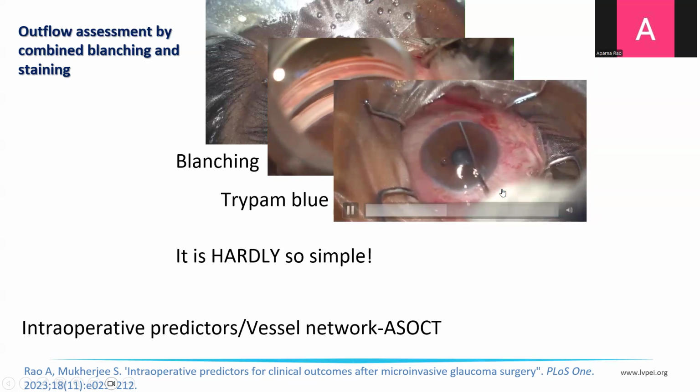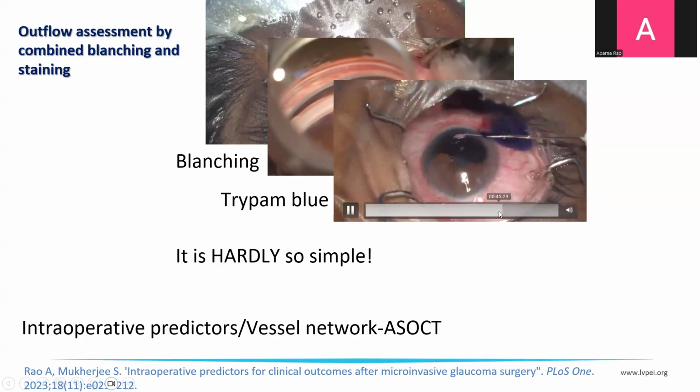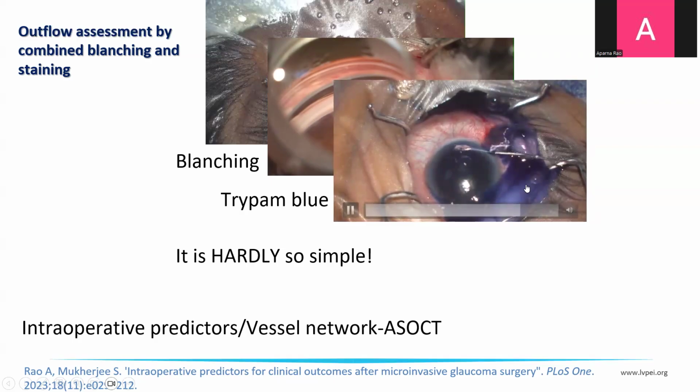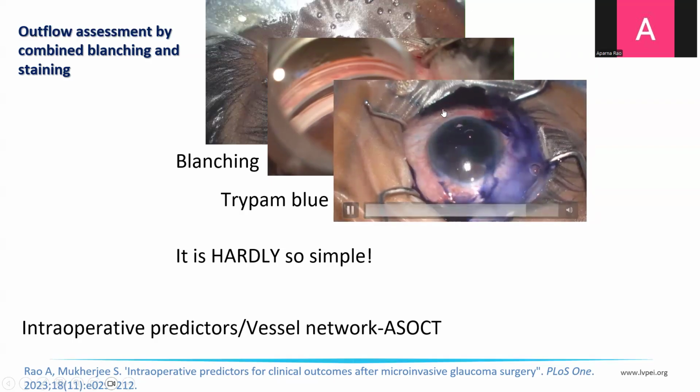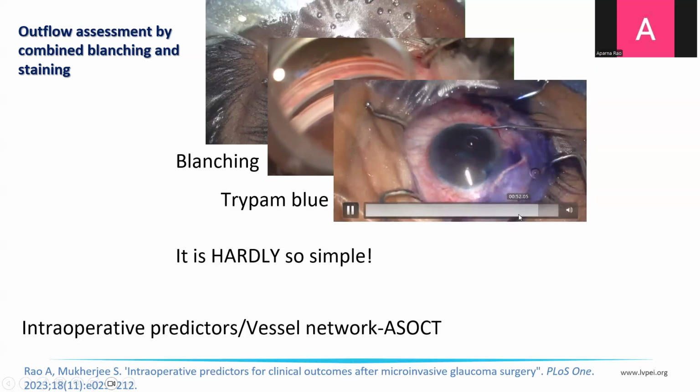However, the venular staining now is seen to be restricted to only 1 or 2 superficial episcleral veins, while the rest of the area remains blank.